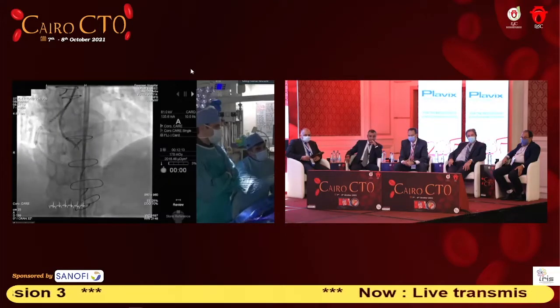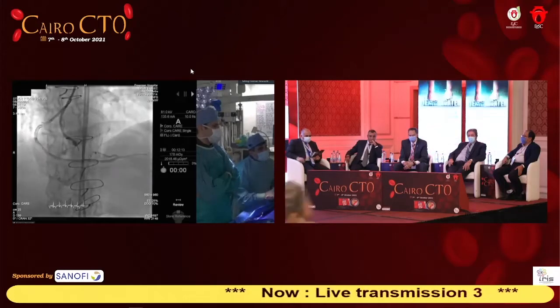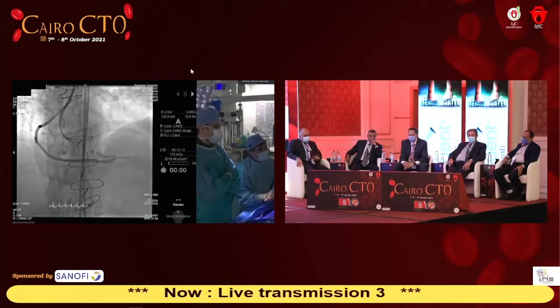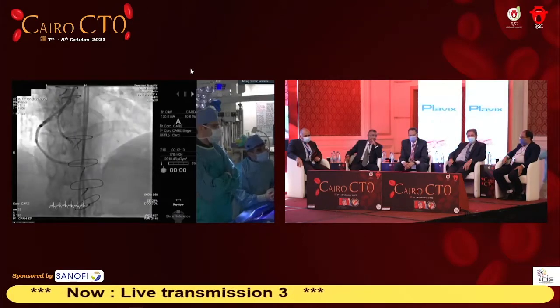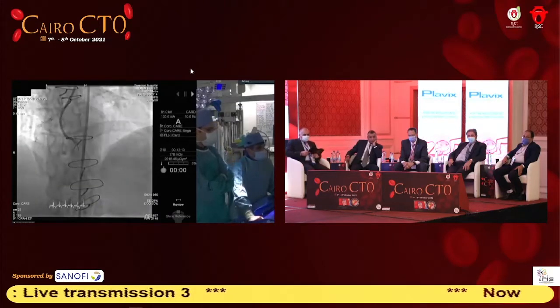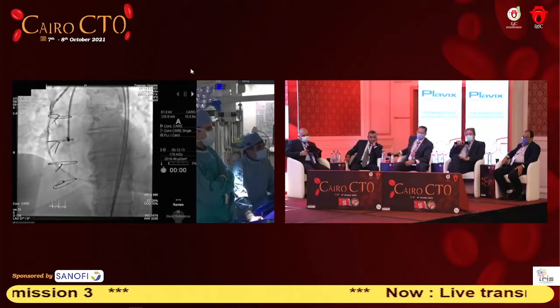And I could see it very easily. And navigating this, it may be a little tricky around it. You could see the tortuosity in the LV branch as well as in the crux of the RCA. But it is a safe approach and a very controlled one. And this is what I kind of did today. Now go forward. Yeah. So we went retrograde through the vein graft.